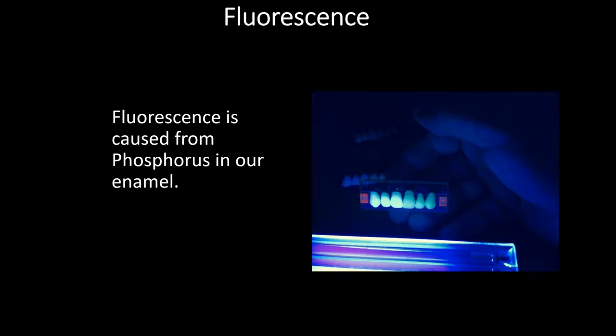Natural teeth have fluorescence in them. And so it gives them that life quality, vitality, life. And so again, under different lighting settings, you don't want teeth to look quote unquote dead, you want them to appear alive. And that's why VITA puts phosphorus into the product as well to make it more lifelike. So the attention is to the detail to make it look real.